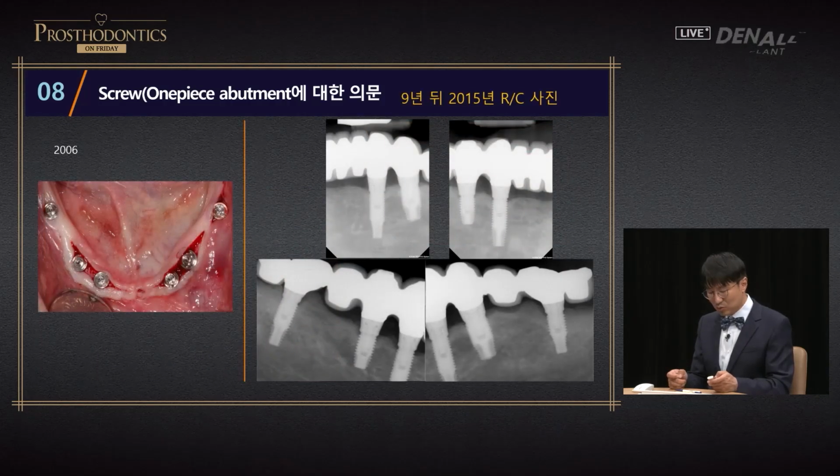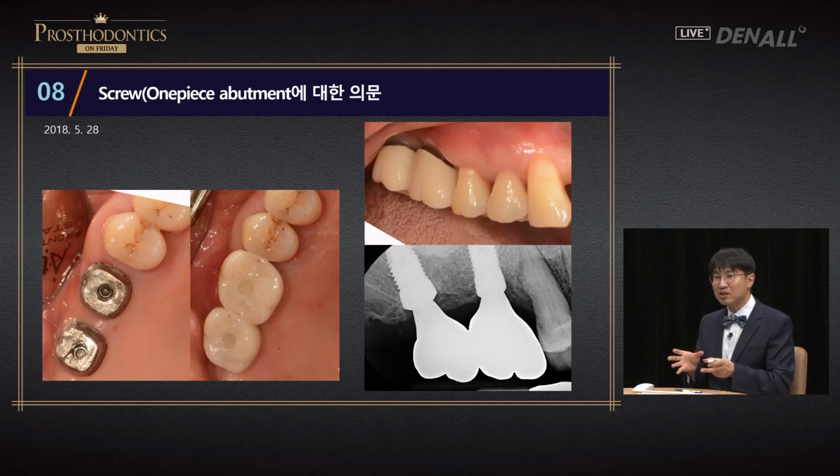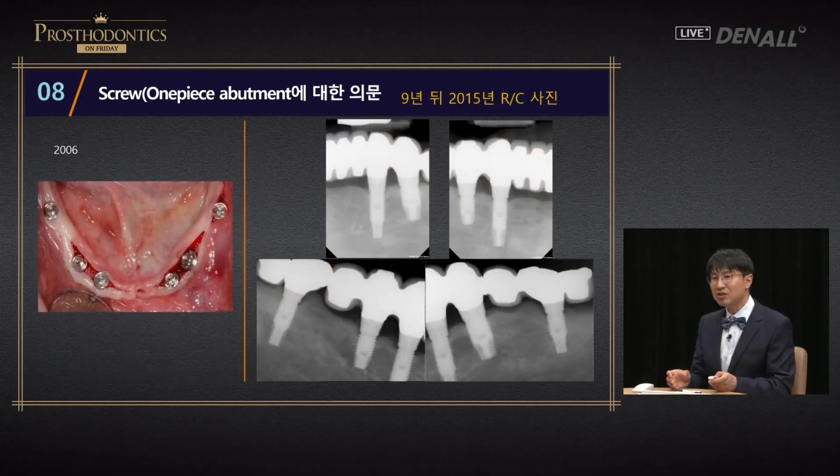The one-piece abutment does not rotate, so why does it loosen and fracture? Because the amount of sinking is not significant. I think if you do not do retightening, preload can be lost. I think you need to use an abutment where retightening is possible.